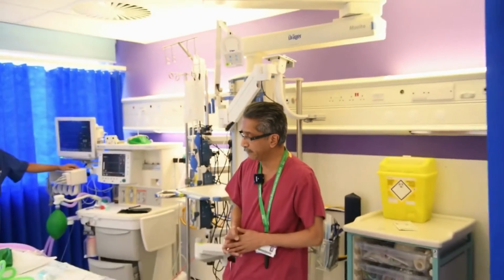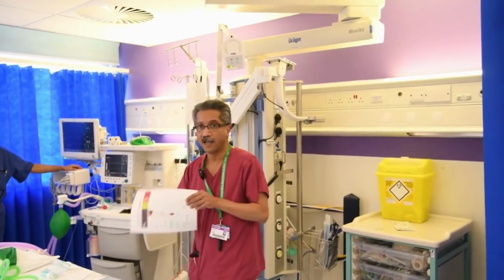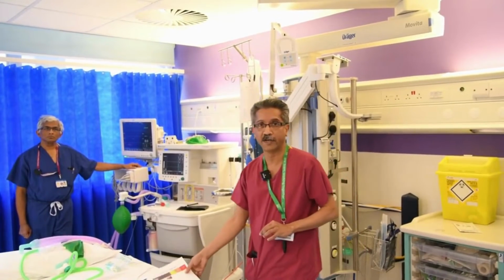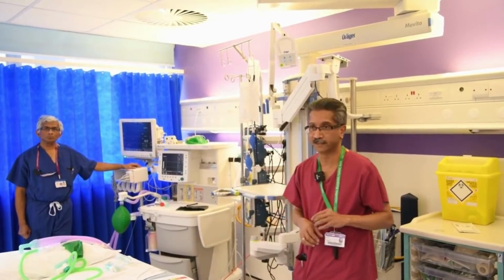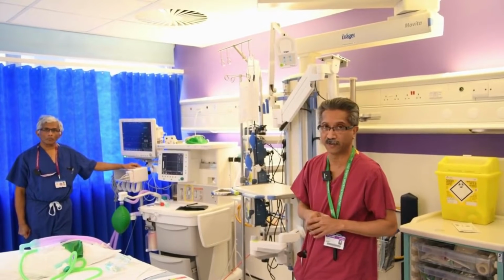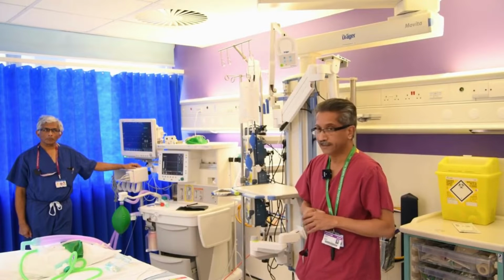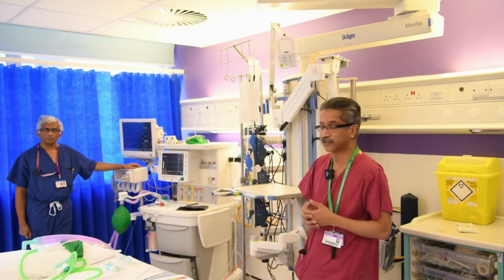When you're coming to see a patient who's on a ventilator, we would expect you to be wearing personal protective equipment, and the guidance on the PPE on donning and doffing is available in the hub. There are separate videos which we have already put up on the hub, and you will be able to access it. This is when you have got a patient who's actually on a ventilator.